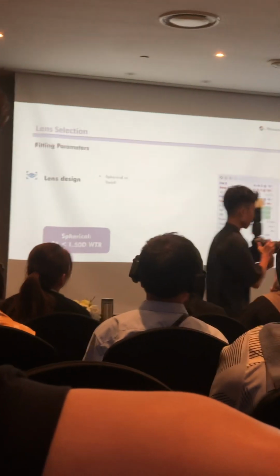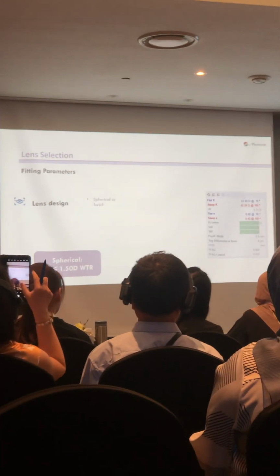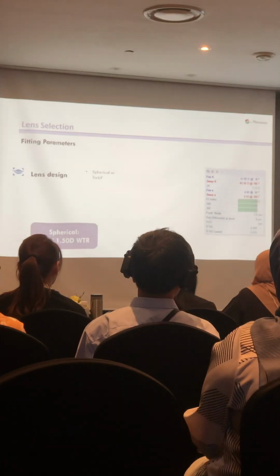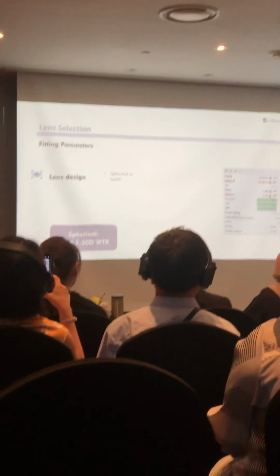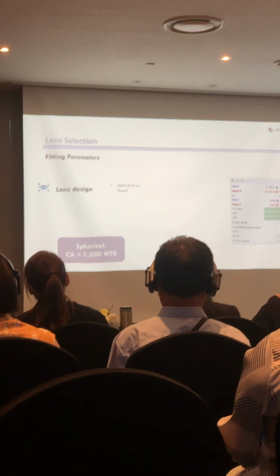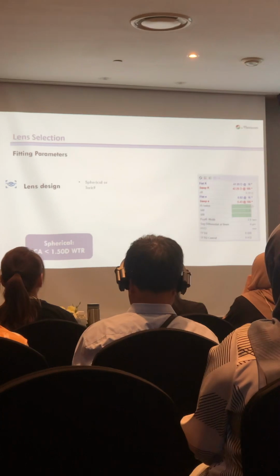So it will tell you the corneal information at the 8 mm or 7 mm area. Why? Because this is where the lens sits on the cornea. When we fit patients, the alignment zone is at this area, which is important for lens settling. We recommend that if the sagittal differential is below 30 micron, you can proceed with the standard design. You don't need a toric design for that. If it is above 30 micron, then we have to go for a toric design. So these are some tips when we choose the design for the patients.